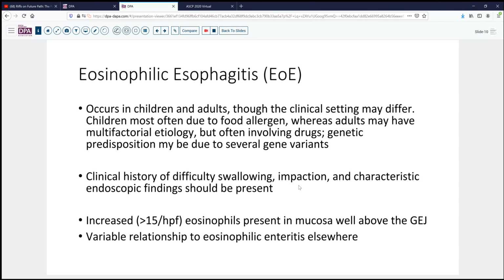So our final diagnosis today is eosinophilic esophagitis, in this patient secondary to a dietary supplement, and probably associated with eosinophilic gastroenteritis in other foci as well.